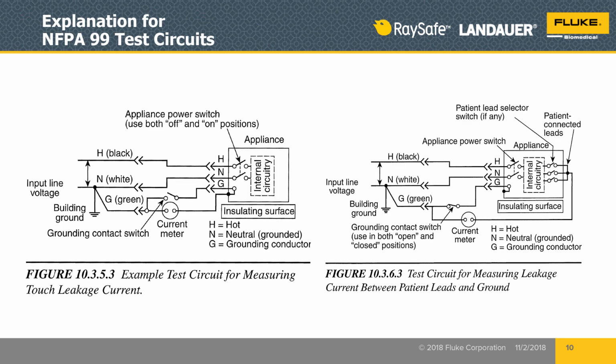I wanted to show here a couple of the diagrams in the parts of NFPA 99 dealing with electrical safety, especially because we're encouraging everyone to go look at the standard and use these references to dig in and understand the specific bullet points we're calling out. A couple of these diagrams are in there and they look really scary and unfamiliar, but I wanted to break them down a little bit and spend a little time. I'm not going to beat them to death, I promise.